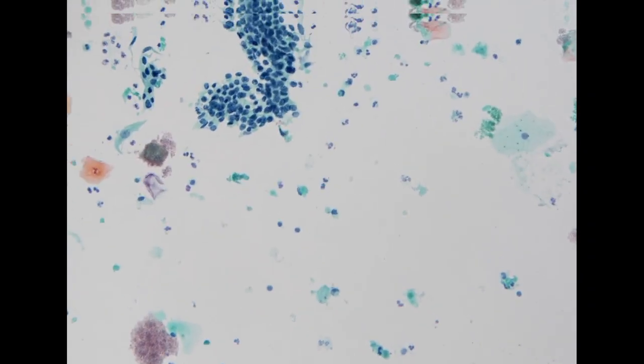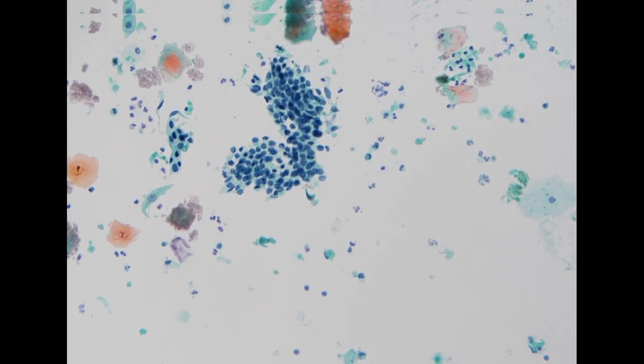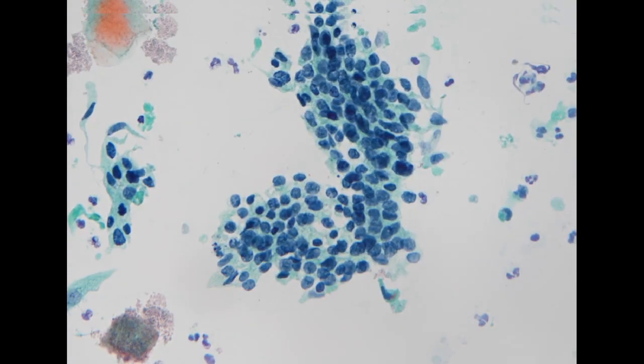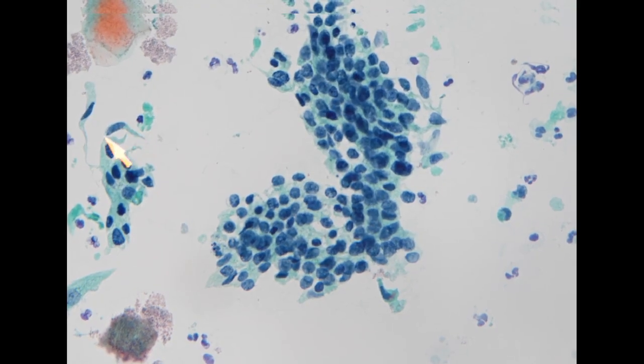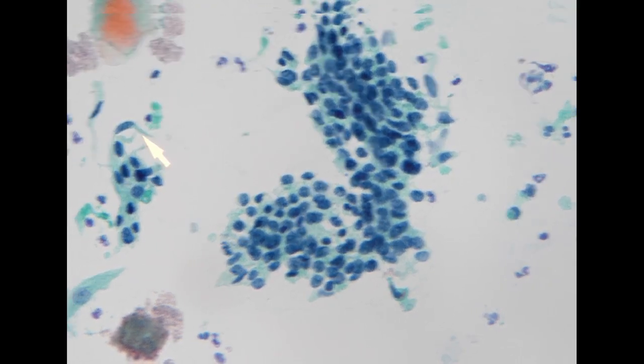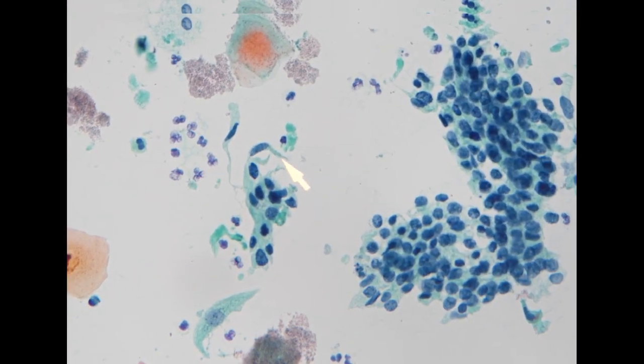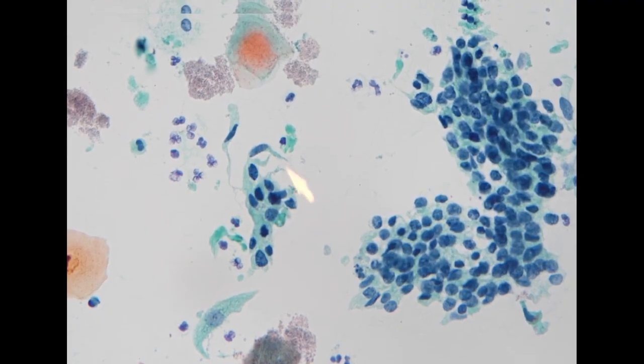So then we go to another cluster. Here it is much clearer that this is a quite abnormal cluster of cells, relatively preserved. And in addition to the hyperchromasia and angulated nuclei with coarse chromatin, we also see some cells showing atypical spindling features, which suggests that there might be some squamous differentiation.